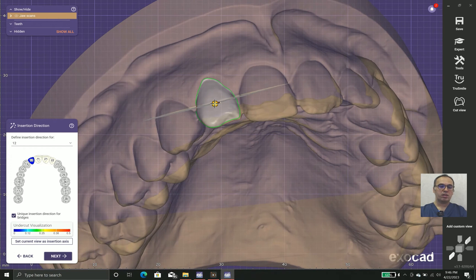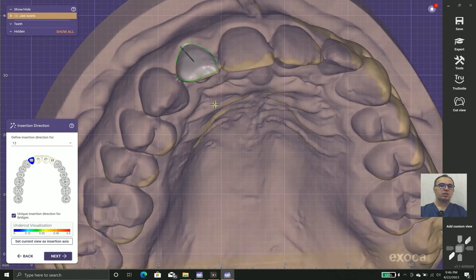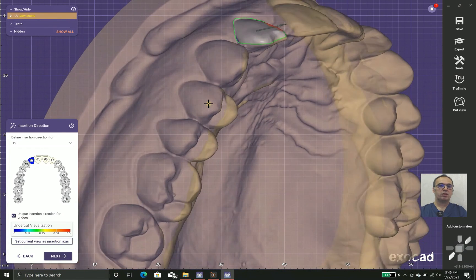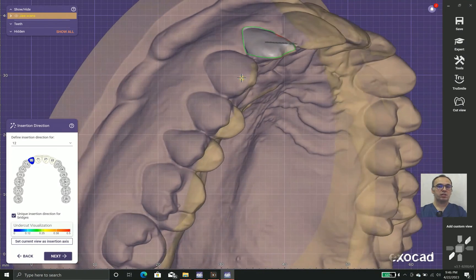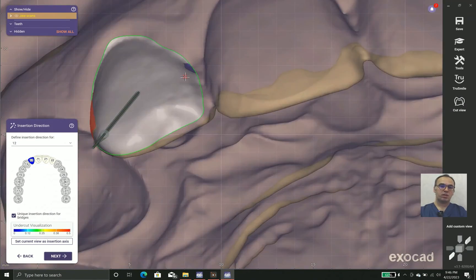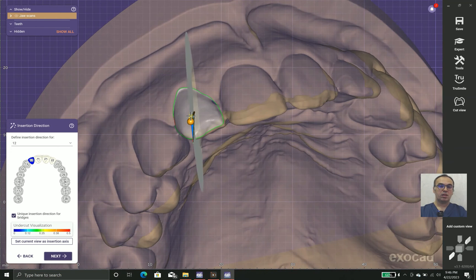Regarding insertion direction — as you can see, we have some undercuts in mesial and distal. When you have a lingual lip, you must choose an incisal insertion direction. But I prefer to use a buccal insertion direction, which helps reduce the undercuts.